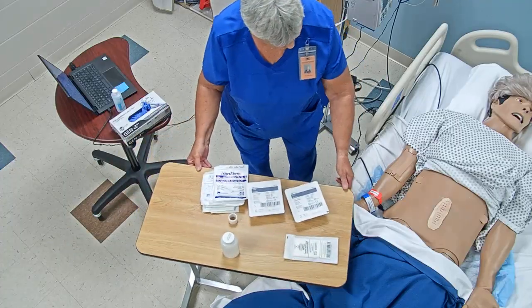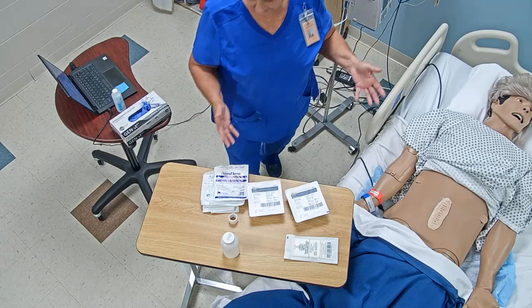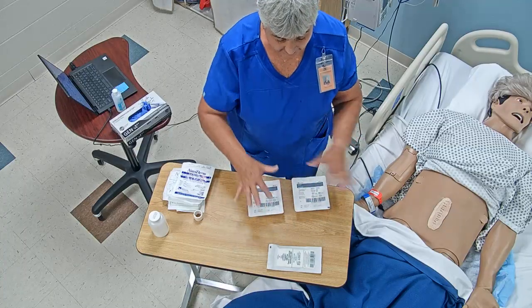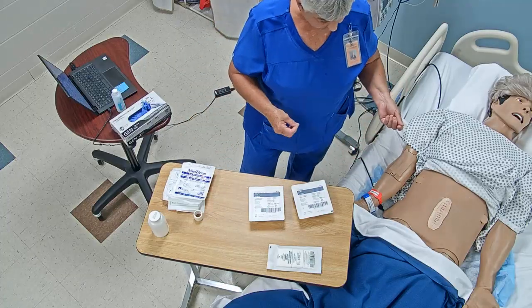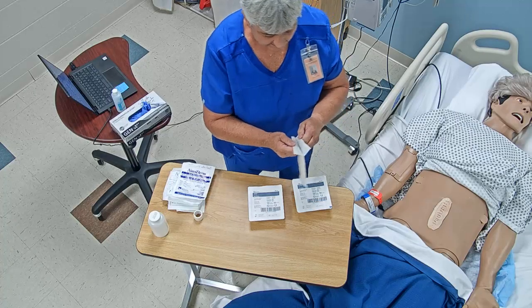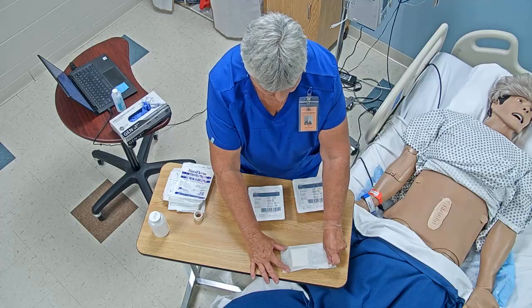So I think we've got everything. You've got my bottle bag here. We've loosened the adhesive on there, and now we're ready to start setting up. The way that I set up is the thing that you're going to be using last is the furthest thing away, so you're not crossing over your items. So remember sterile technique, sterile to sterile, sterile over sterile, and so I'm going to open up my ABD, and we've already checked all the sterility, the intactness, and all that kind of stuff. So I'm going to lay it right here, and I'm going to be setting up my table in a way that I'm not going to be turning my back on my sterile field.